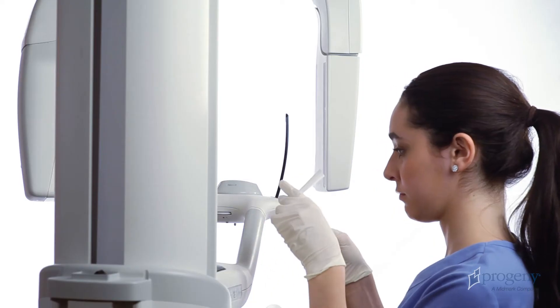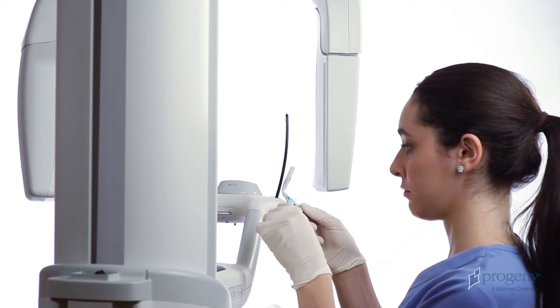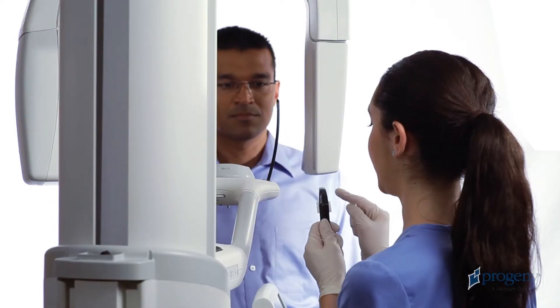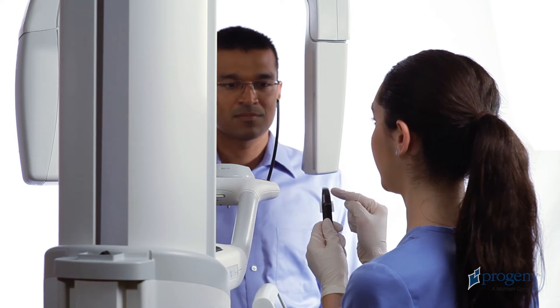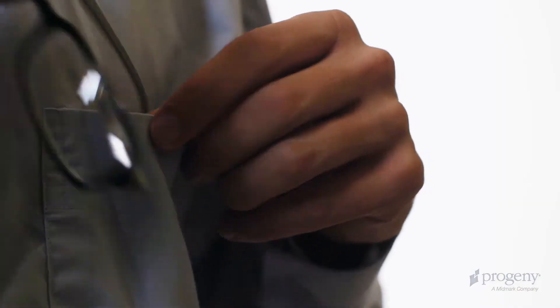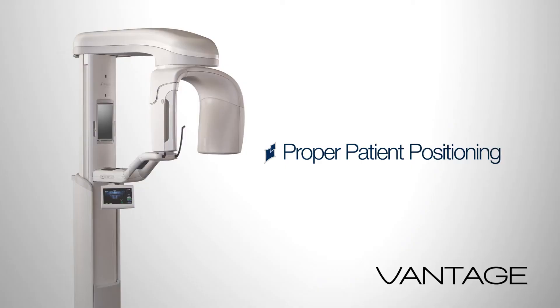Explain the examination process to the patient. Place a sanitary barrier on the bite piece. Explain to the patient that the anterior teeth will be placed within the grooves of the bite piece. Ask the patient to remove glasses and jewelry. Begin patient positioning.